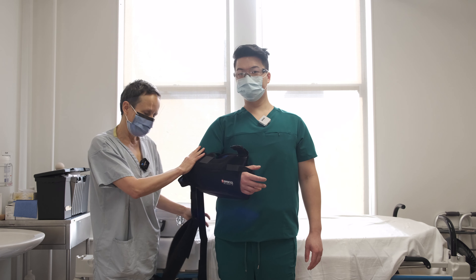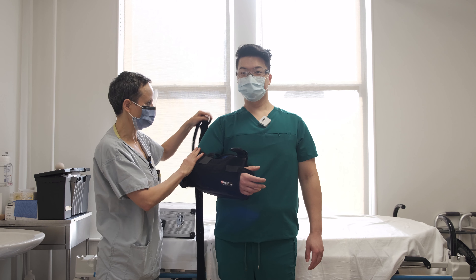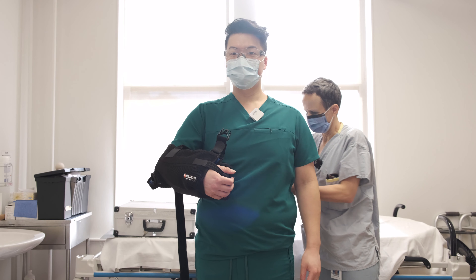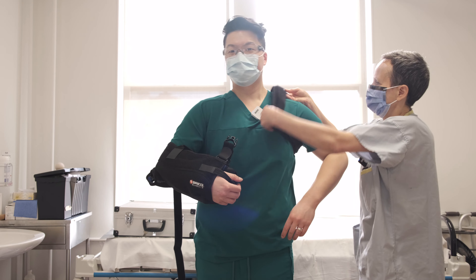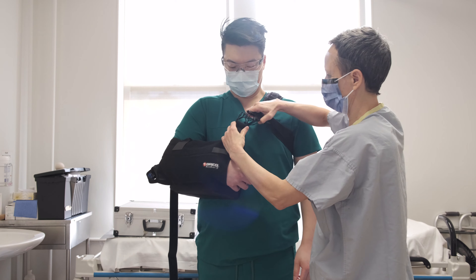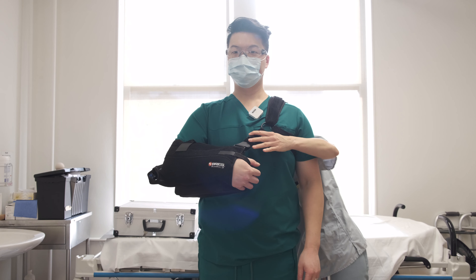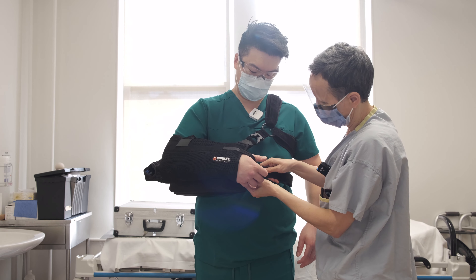What we like about this sling is that the good shoulder supports it — it doesn't go around your neck and they're pretty easy to put on. On the other side, the good shoulder, you go in with your arm like a backpack so that the good shoulder holds the strap, and you clip it in here. And then there is one more strap that goes around the belly and clips in here.